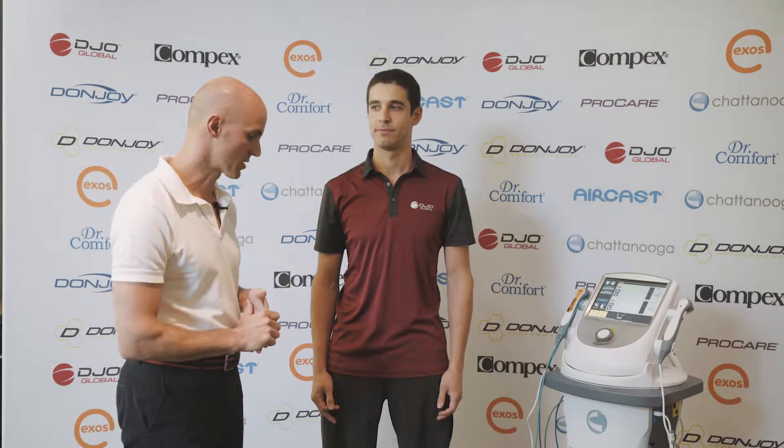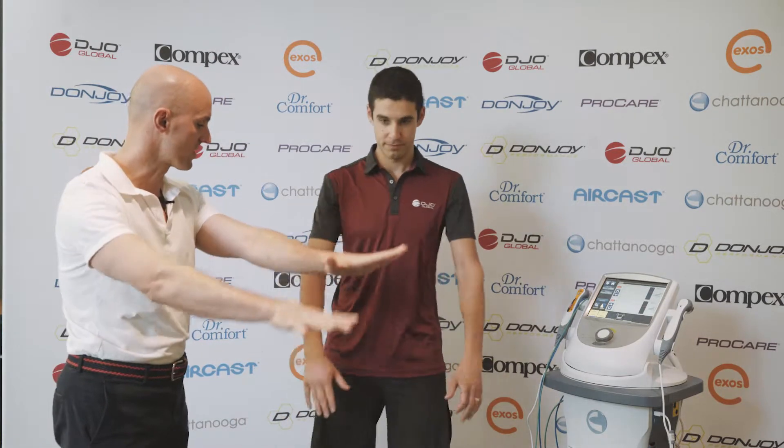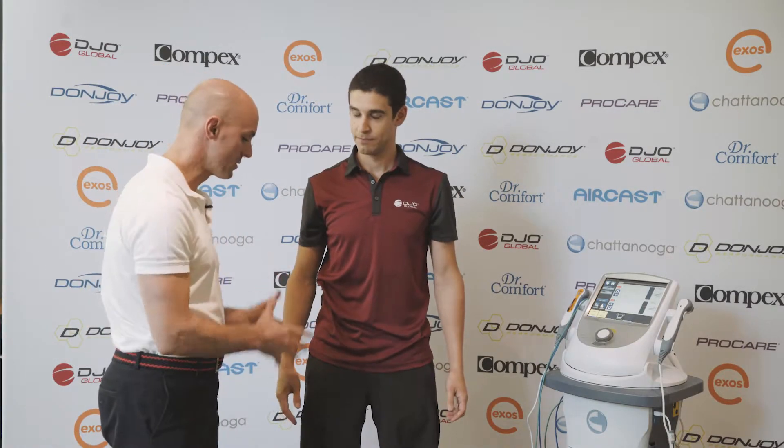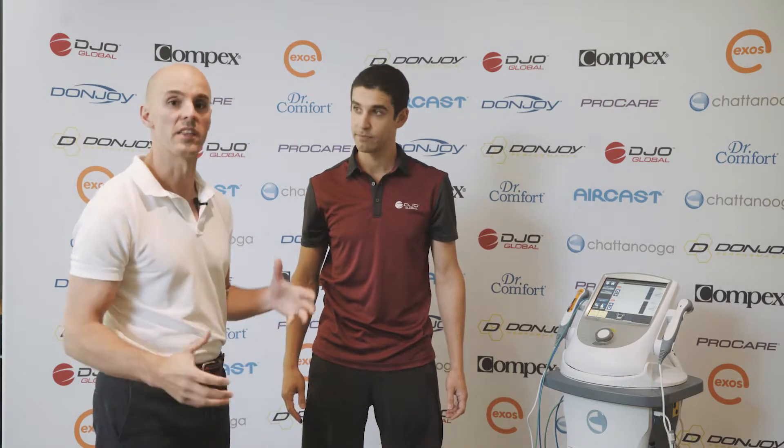So we're going to have a look at Ryan doing a squat. Ryan, if you can just stick your hands out in front and do a squat for us and back up. Ryan's got great squat technique — he sits back into his hips, his knees track well, there's good control there.